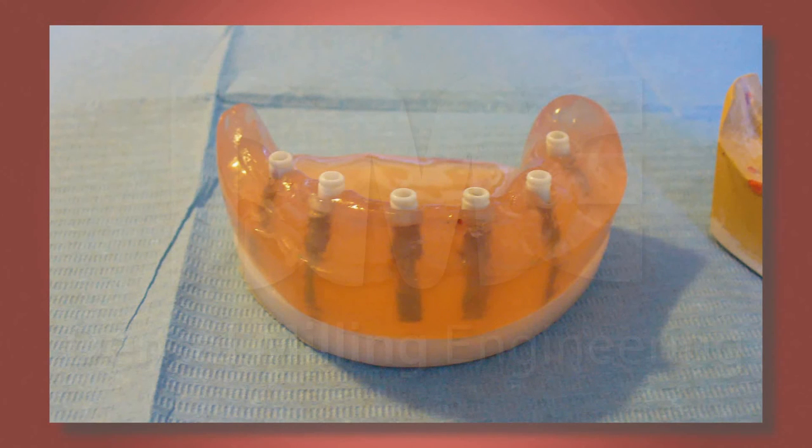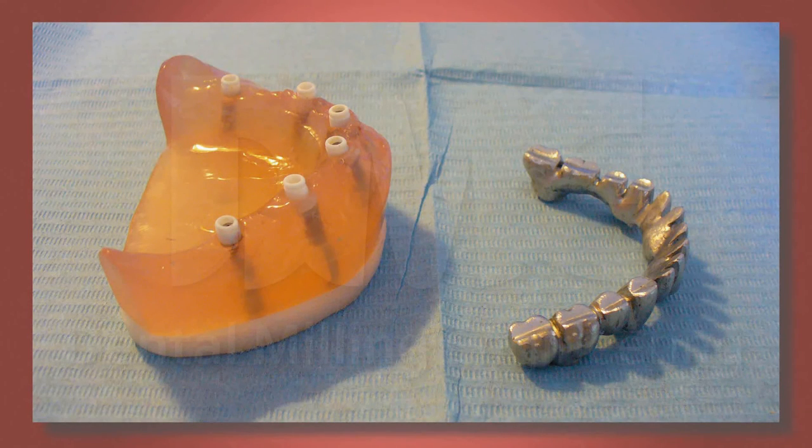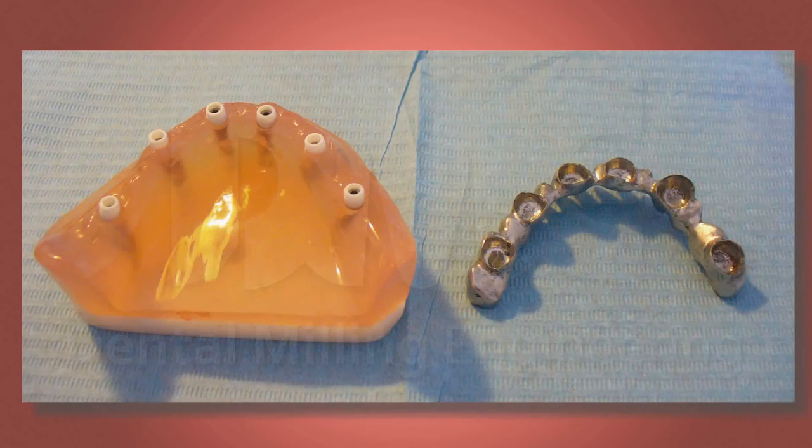Here, you can see the angulated position of the implant replicas through the replica transparency model. In this slide, a side view, you can see the different angles much better and observe in detail how the Zir-Lock male has already corrected the problem of divergences in the implants. Here, you will see the metal structure and casting, with the cavities prepared for cementing. The retainer holders will follow.